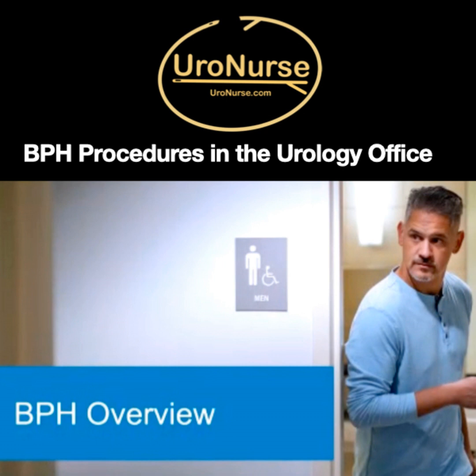That is exactly right. I think Lori, we tried Rezum. I see better outcomes as a nurse with Urolift. And the reason why is because when we did Rezum, they had a catheter for a lot longer than with Urolift. And they had much better outcomes with the Urolift as opposed to the Rezum. As nurses, with the Urolift, I used to see people 2 weeks prior. We used to do a urine to check for infection. We used to go over the bladder irritants, which was huge. We used to give them the expectations that you were going to have the worst urgency and terrible symptoms. But with the Rezum, it seemed like it lasted a lot longer.